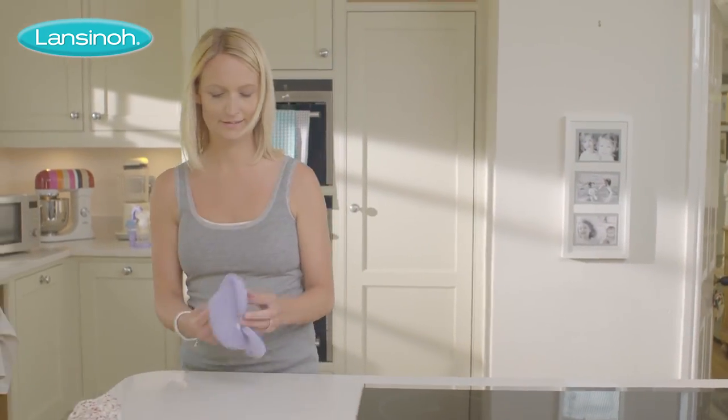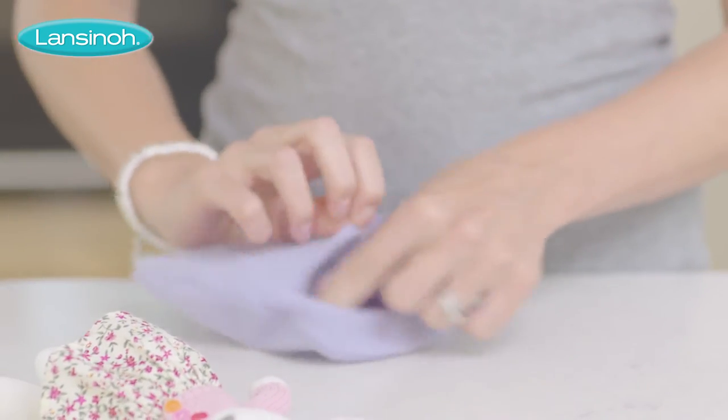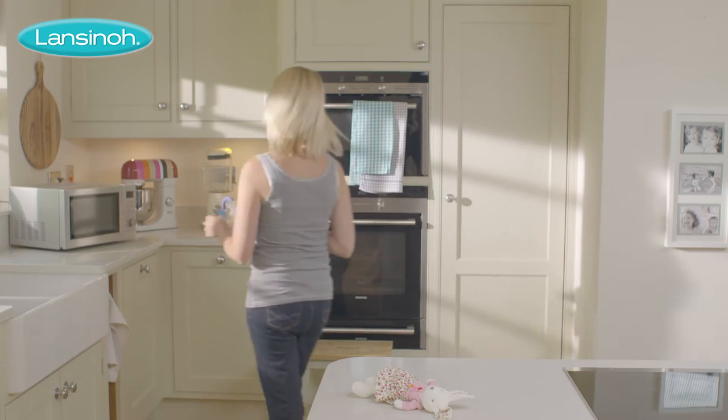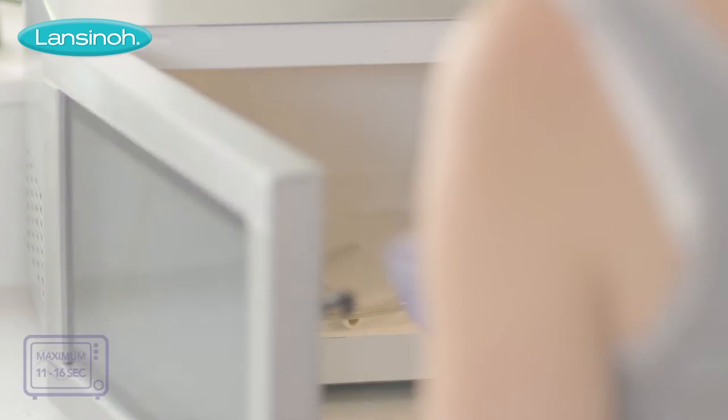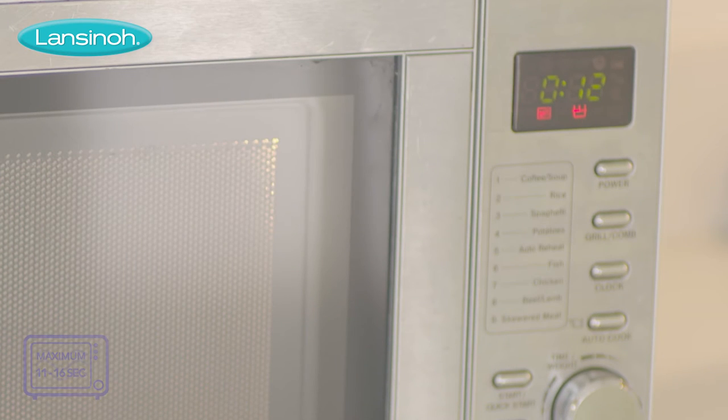Heat therapy is perfect for relieving mastitis and blocked ducts. Just pop one of the two reusable treatment packs into the soft cover, place in the microwave, following the specific heating instructions exactly, and apply to the affected breast.